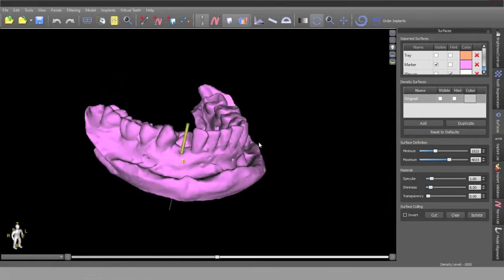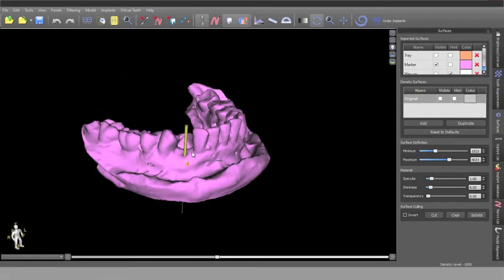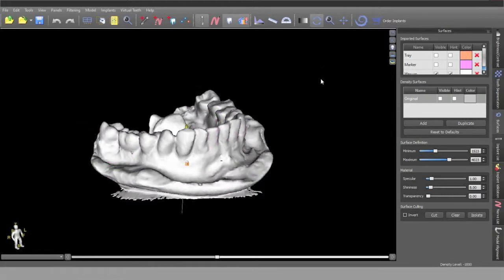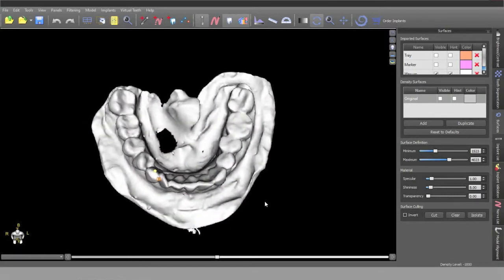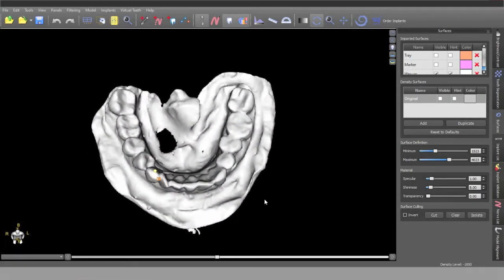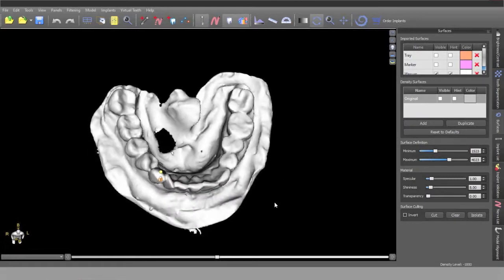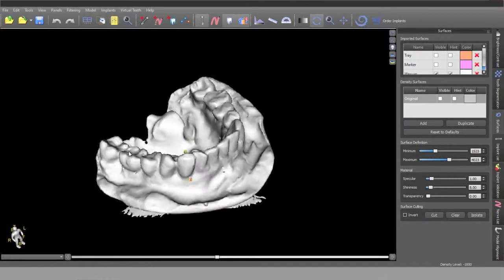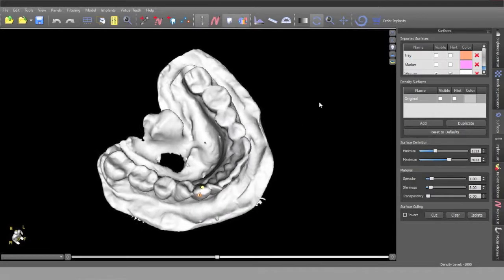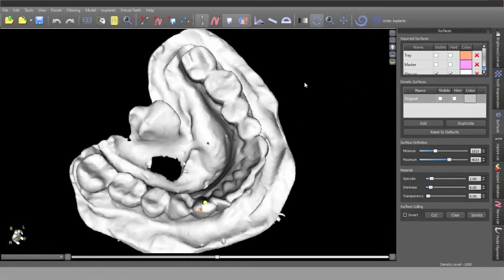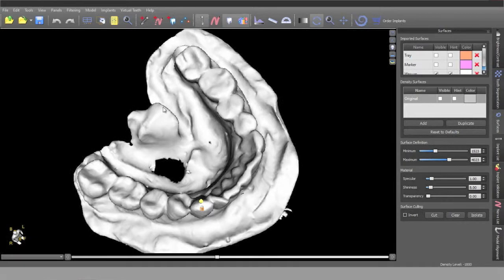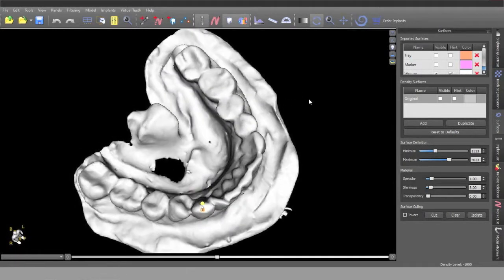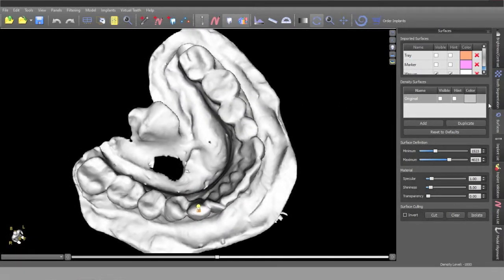So in this particular case we took this tooth out and we had a wax-up done. And so this is an impression of the wax-up as a model and we scanned it in. So I wanted to do this because of the overlap. I was concerned about the position of the implant relative to the position of this tooth. So we're using a wax-up here to position the implant.